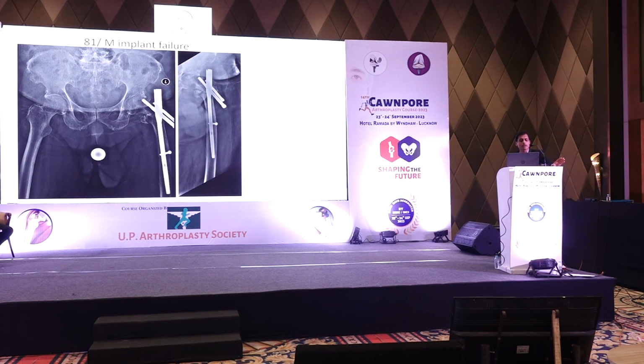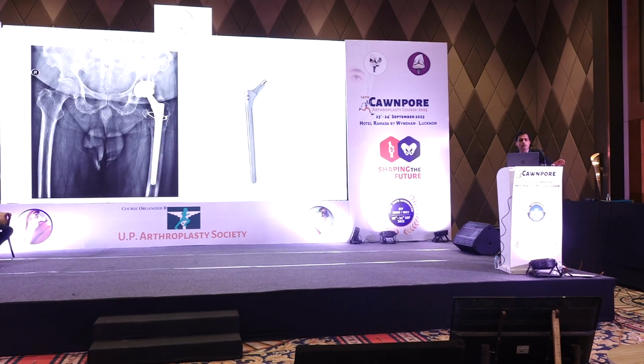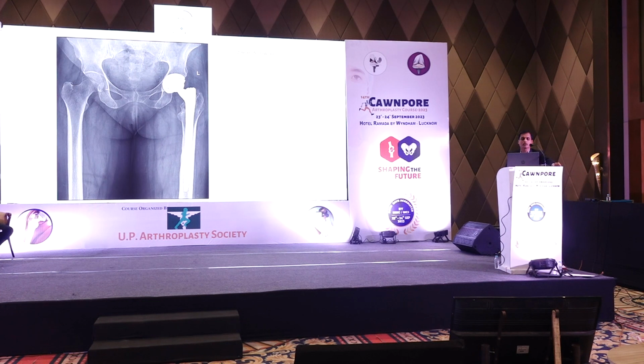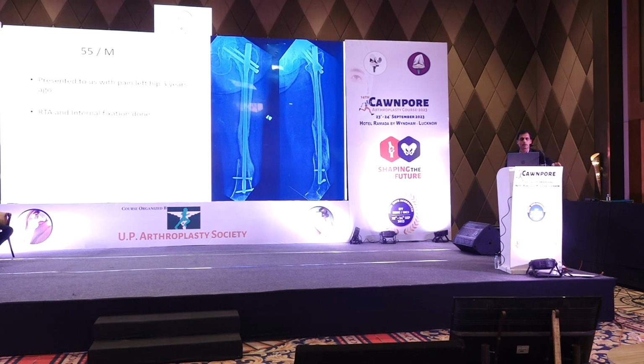Again, one more example, an 81-year-old male, implant failure, like what Dr. Mrinal showed. Again, removal and a distal loading stem. The key point here is, don't use a longer stem unnecessarily. You will get a false fixation. So you have to use a thicker, short, distal loading stem. That should be the choice of implant. Again, one more example. The key here is to cross the distalmost screw. That is the 2 years follow-up.